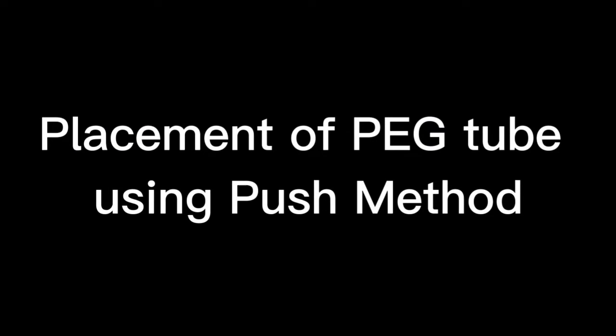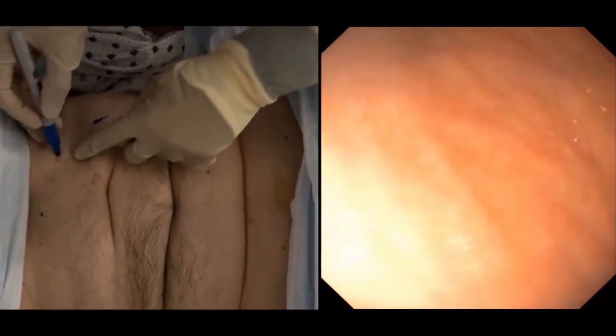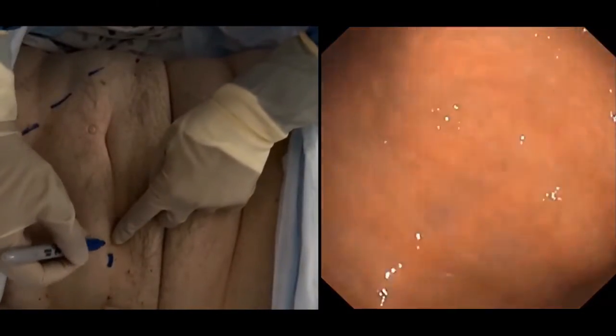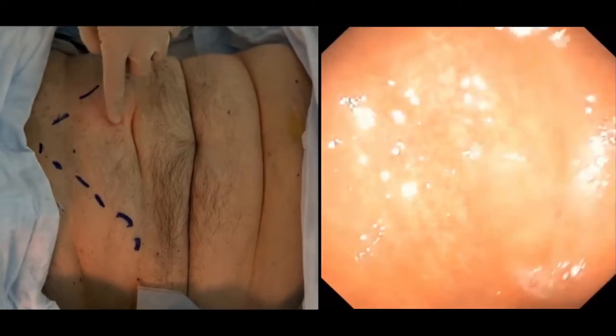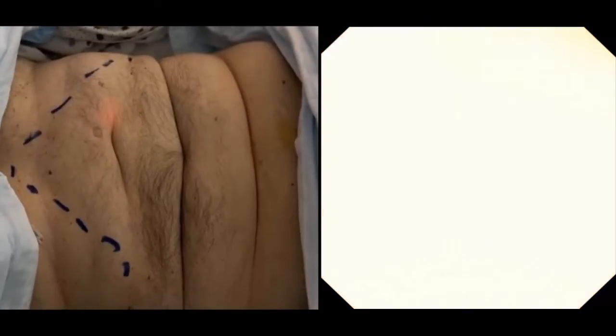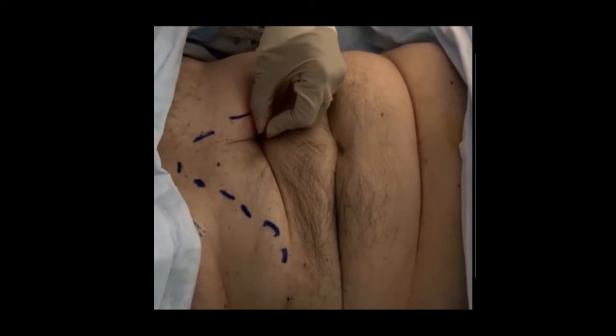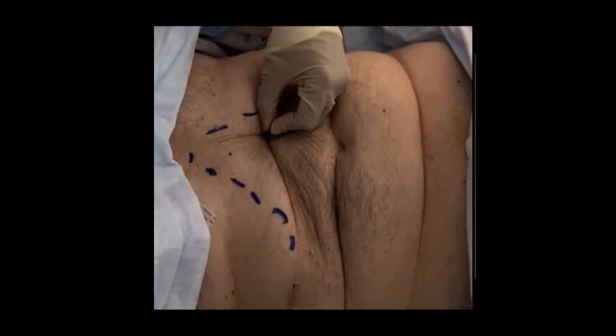With the endoscope already inserted and the patient anesthetized, we start by marking the costal margin so that we insert the tube at least 2 centimeters away from the costal margin. We then transilluminate the abdominal wall using the endoscopic transillumination light to mark the site for tube insertion.